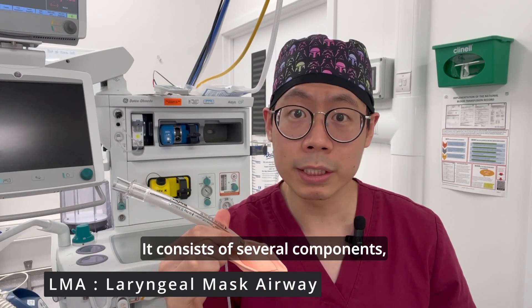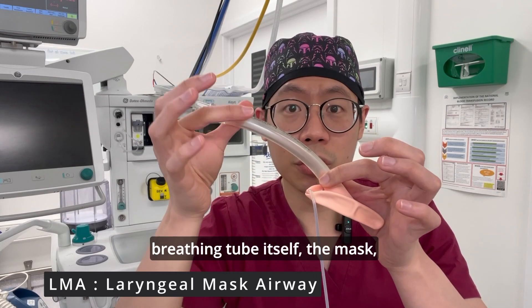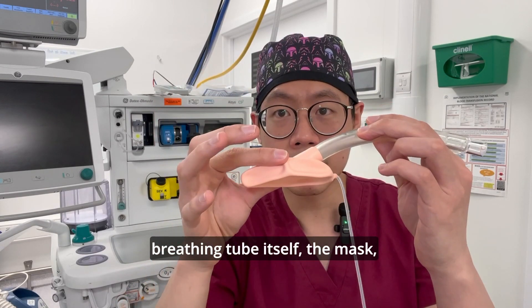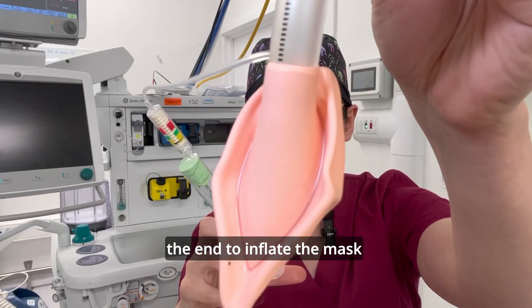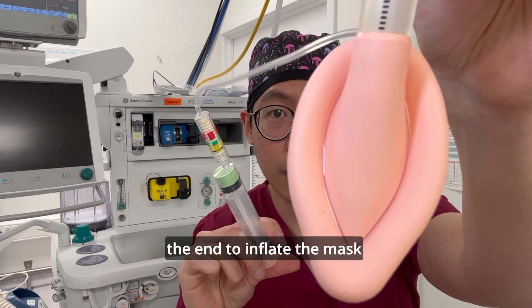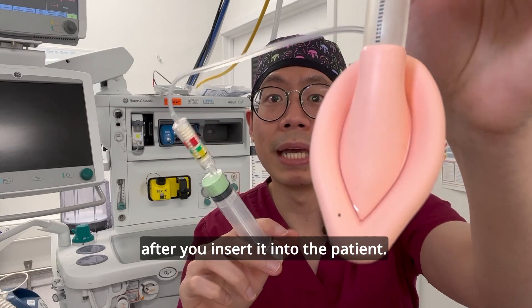The LMA consists of several components, one of which includes the breathing tube itself, the mask, and also a connector port at the end to inflate the mask after you insert it into the patient.